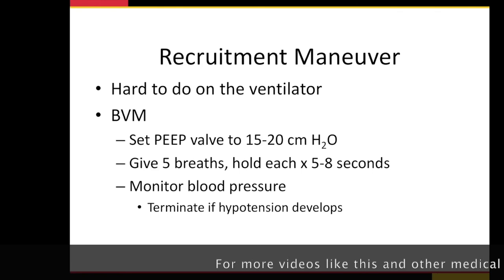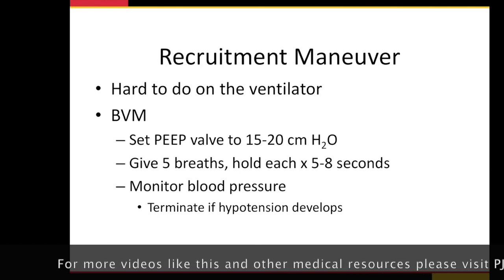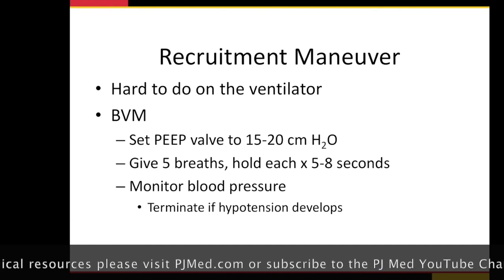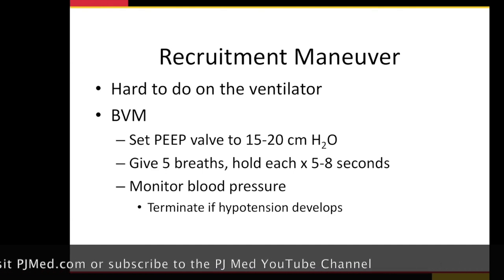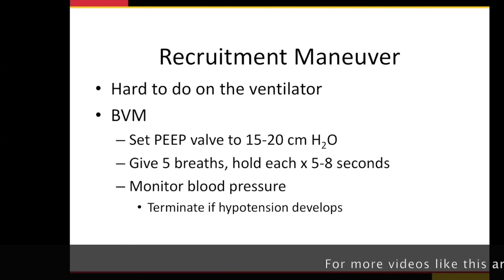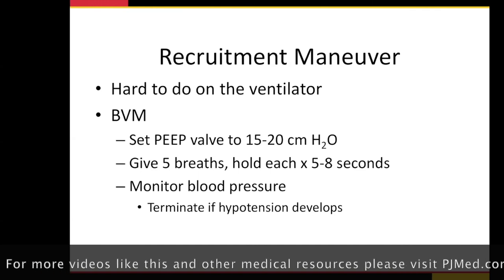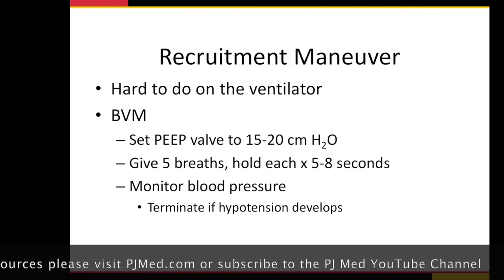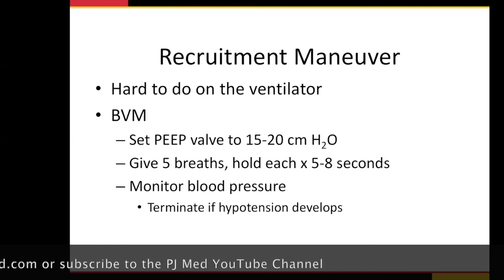One way you can do this is to use your bag valve mask and put a PEEP valve on it. You guys have PEEP valves, or you will. You can just squeeze the bag and hold the pressure in that system. You can do this over the course of a couple of long breaths. You guys have all done this, I know you have. It's bag valve ventilation, just holding that breath, not releasing it right away, so that you're imparting that pressure to the system. That's what we call a recruitment maneuver.